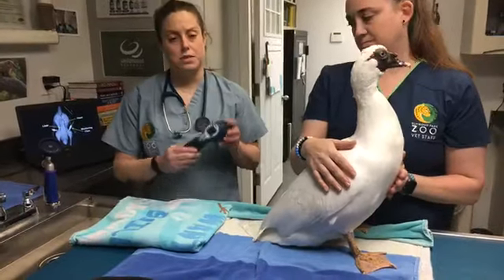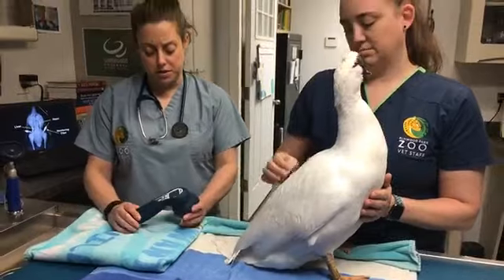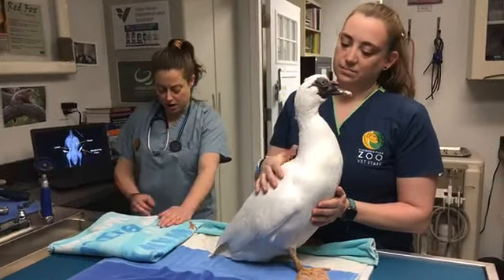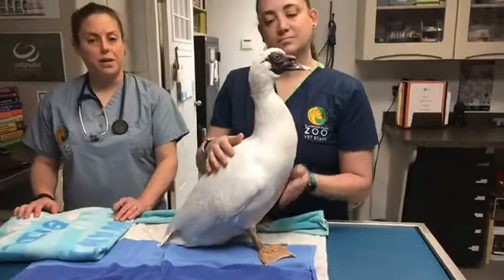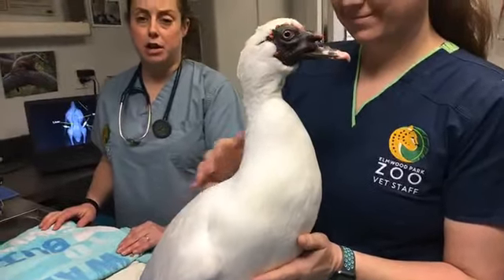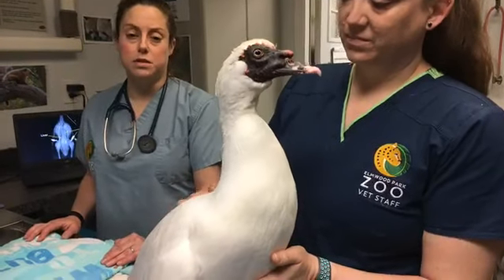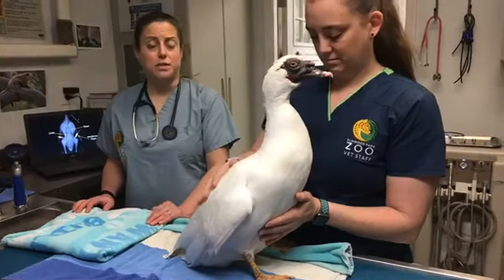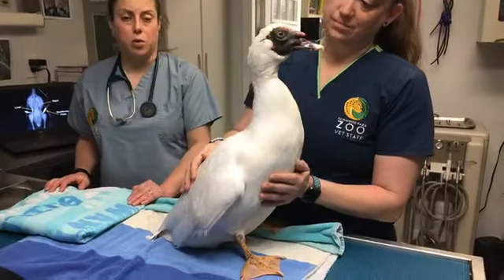Some other things we're able to do for our animals, particularly our older animals, is use this cold therapy laser. Mr. Wilson is doing extremely well and does not have any signs of arthritis, but if he did, we would be able to use this cold therapy laser to stimulate blood flow and reduce inflammation. As part of our geriatric animal medicine program here at the zoo, we rely on companies who provide us with high quality nutritional supplements and specially formulated medications. We've been extremely grateful to Veterinarian Recommended Solutions and Wedgwood Pharmacy for donating so much that we get to use on our animals to make sure everybody's continuing to do well during the zoo closure.